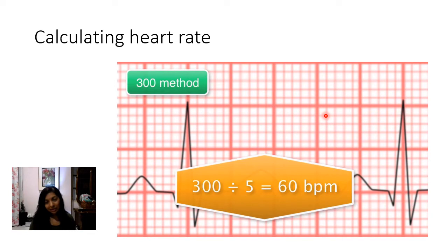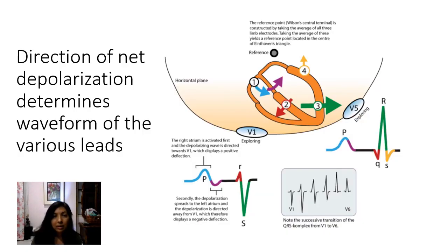Deciding whether this heart rhythm is coming from above the ventricle or below the ventricle, supraventricular or ventricular, you need to look at the conformation of the QRS complex, and we'll talk about that a little bit when we get to the next portion.